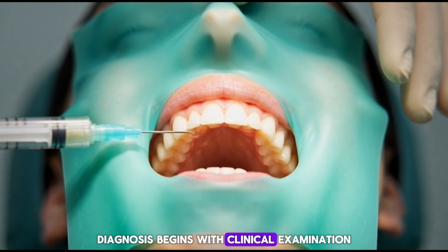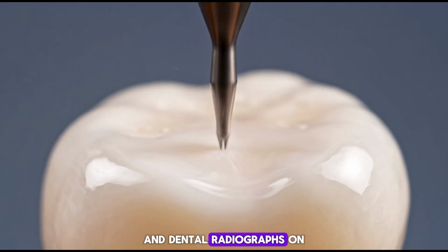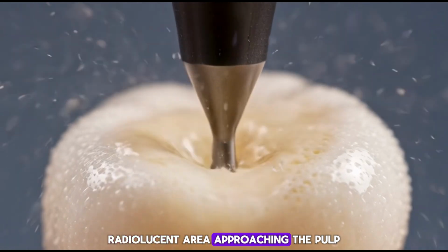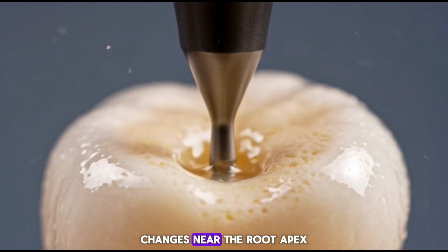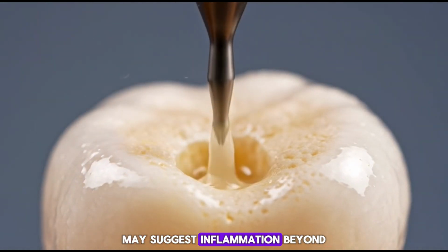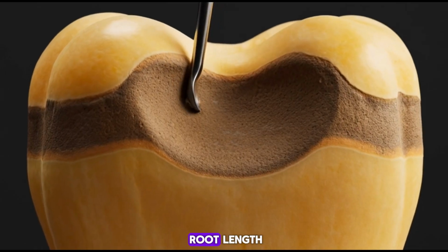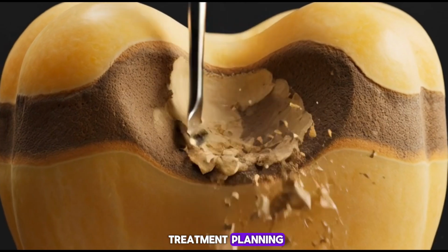Diagnosis begins with clinical examination and dental radiographs. On X-ray, deep caries appears as a dark radiolucent area approaching the pulp. Changes near the root apex may suggest inflammation beyond the tooth. Digital imaging allows precise evaluation of root length and canal anatomy, guiding treatment planning.